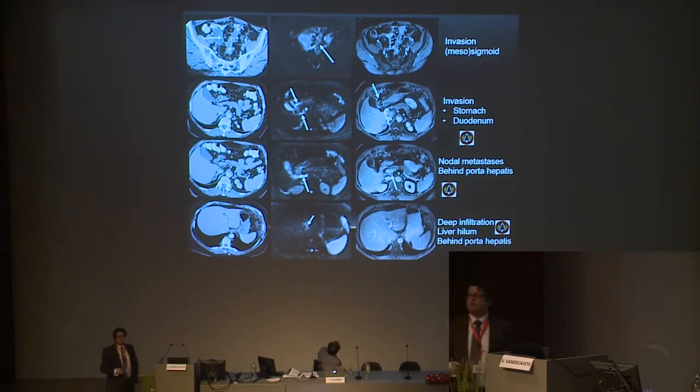That will still depend on the rest of disease if that is operable or not. But let's go higher to the upper abdomen. CT, nothing apparent. Look at the diffusion MRI. First of all, disease spread behind the liver, between the diaphragm and the liver. But here is more interesting, actually. This is the duodenum and the antrum of the stomach.